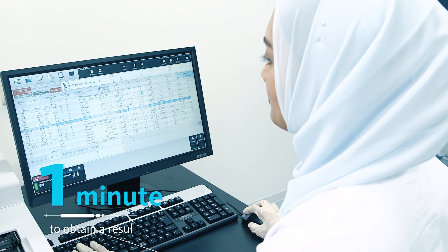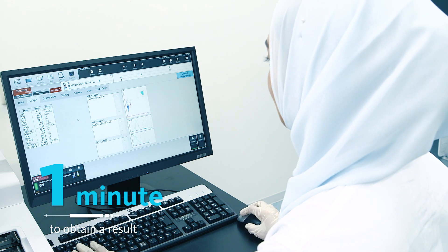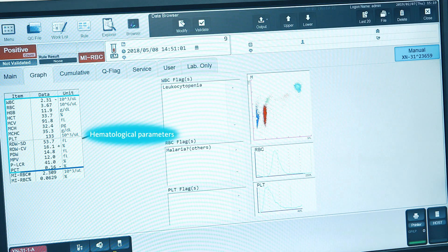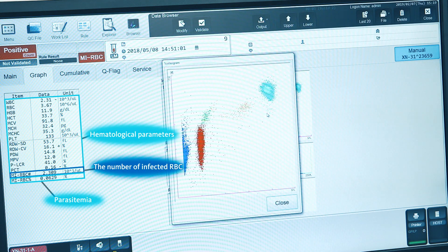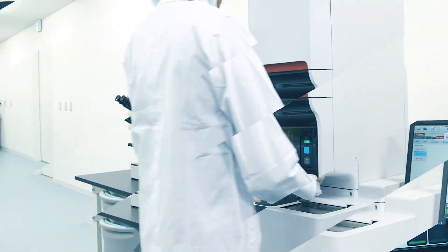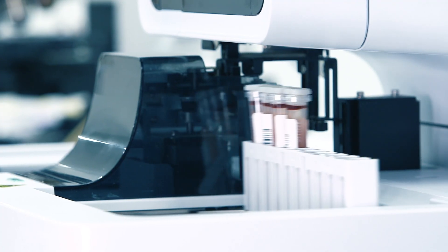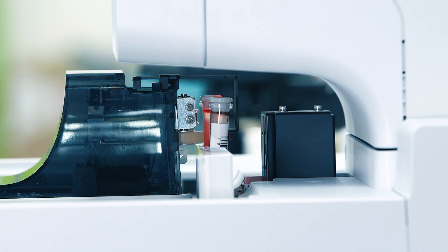It only takes one minute to obtain a result, such as the number of infected RBC, parasitemia, as well as hematological parameters. You can select manual analysis or sampler analysis. This enables more efficient testing.